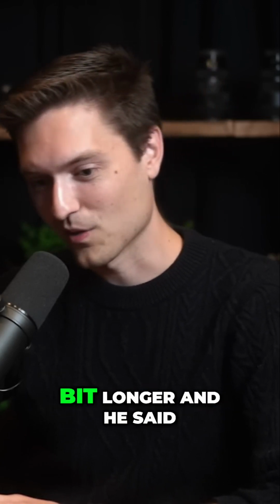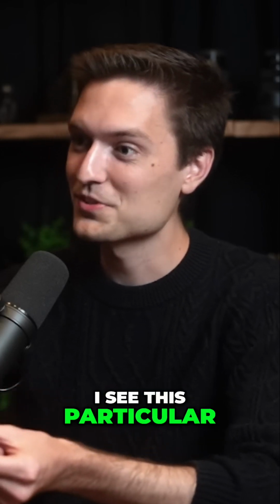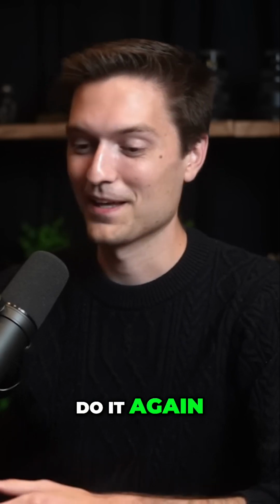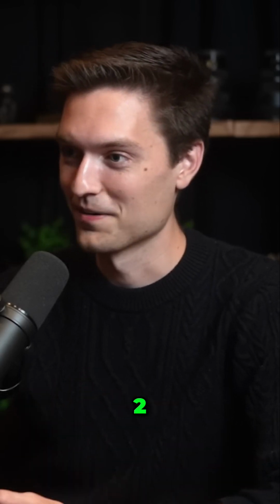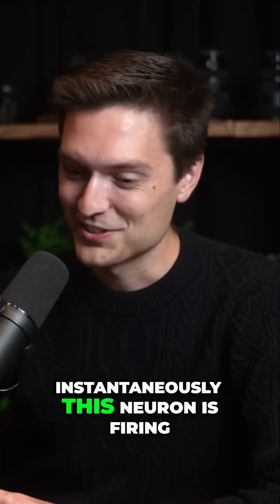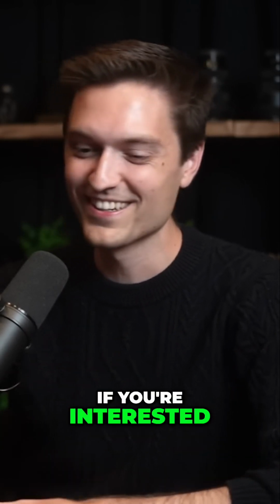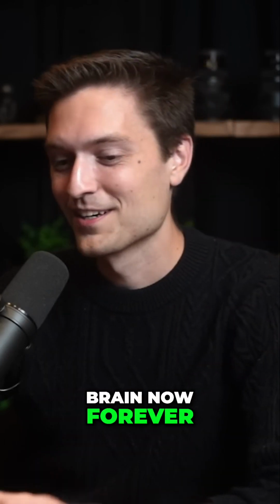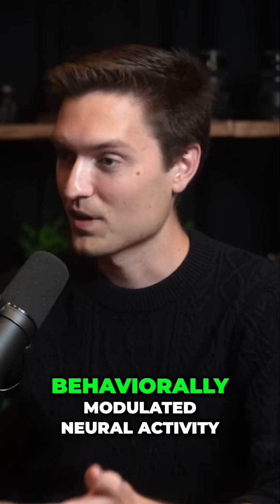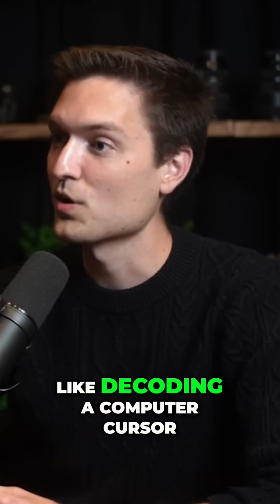He played for a bit longer and he said, oh, when I move this finger, I see this particular neuron start to fire more. And I said, okay, prove it. Do it again. And so he said, okay, 3, 2, 1, boom. And the minute he moved, you can see instantaneously this neuron is firing. Single neuron, I can tell you the exact channel number if you're interested. It's stuck in my brain now forever. But that single channel firing was a beautiful indication that it was behaviorally modulated neural activity that could then be used for downstream tasks like decoding a computer cursor.